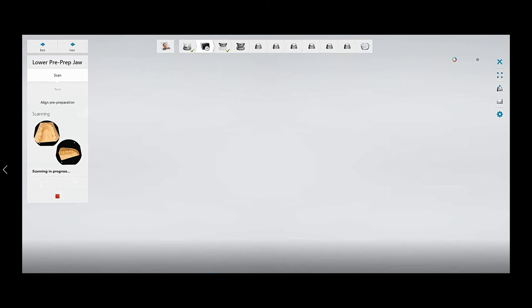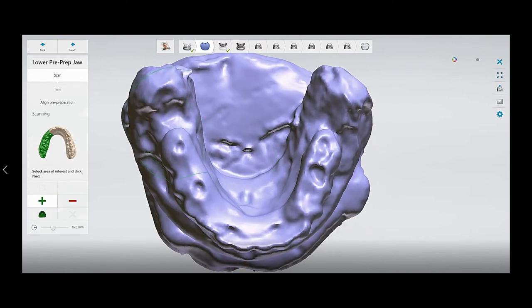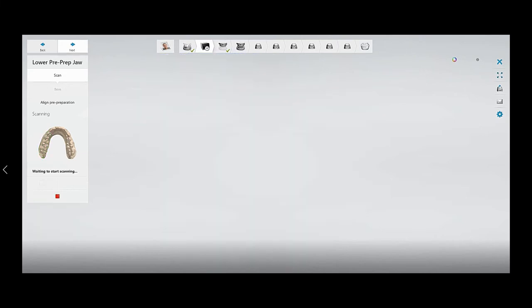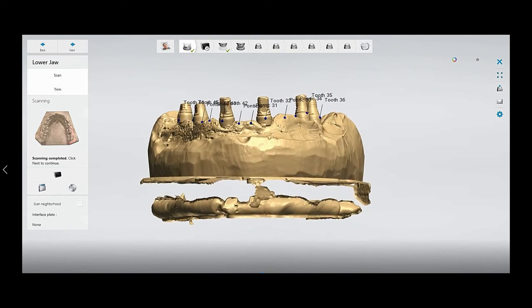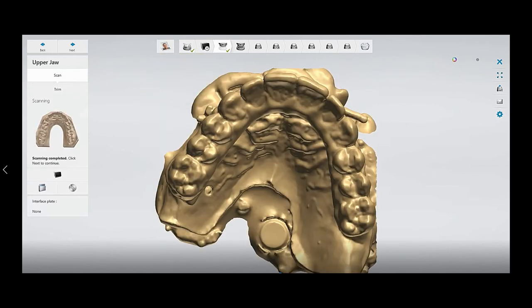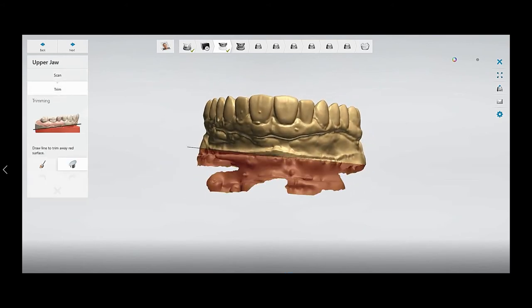Now you can scan the temporary or the pre-op model — place it and you can scan the pre-op model. For your pre-op model, select the area and press Next. Now you can examine your prep model; you can see if there is a missing area, and then you can trim the model as you want. Also trim the opposing model using the plane cut.